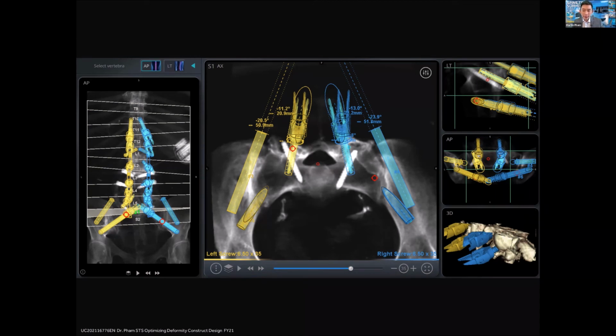I wanted to give her good pelvic fixation in a rigid construct because I didn't want anything to pull out. I didn't want anything to fracture. In the older days, when you were doing things minimally invasively prior to robotics, all you could do was probably 2 pelvic fixation points and 2 rods, because that's the maximum amount that you could do to put things transfascially.